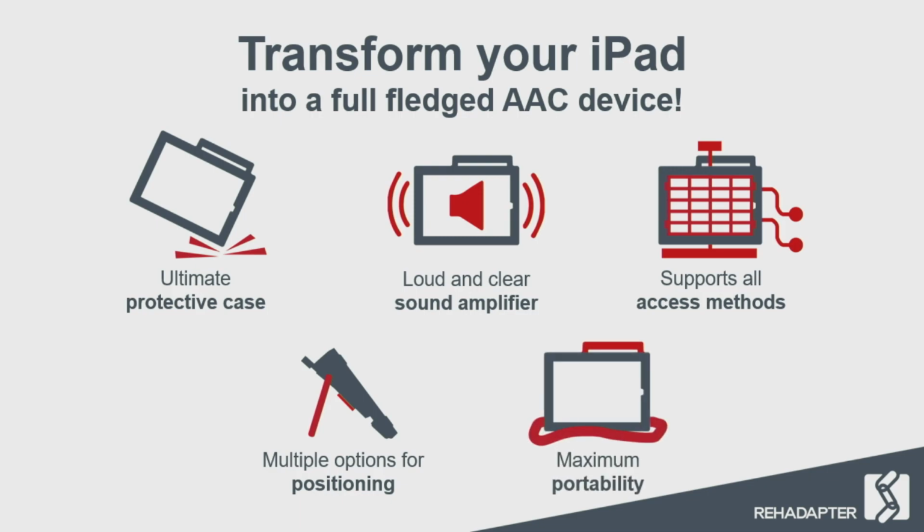So now imagine you have all of these features in one product, in one housing. Wouldn't that be the holy grail in one solution if you have all these accessibility options? What do you think? Yes, no? Okay, good. Let me explain the Holy Grail a little bit better and what we have invented now from scratch in detail.